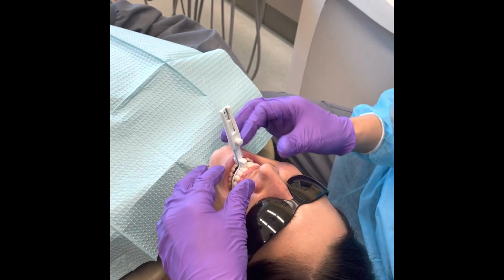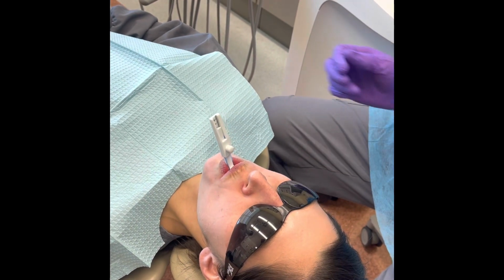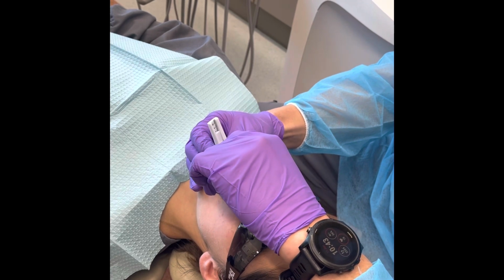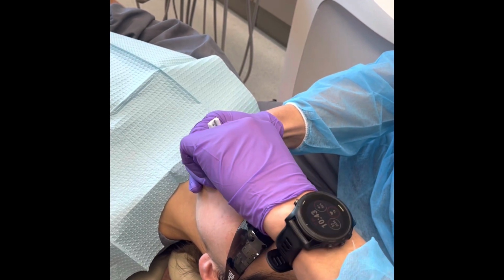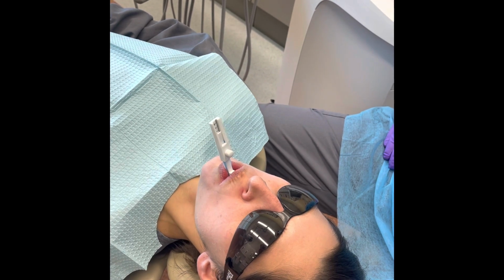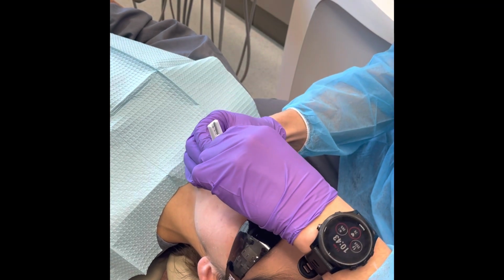All right, so now try to close your lips around this a little bit. Okay, now try to make the snoring sound again. Okay, what I'm going to do is slide your lower jaw a little bit further forward for me. I'll tell you when to stop. Stop right there. All right, go ahead, and I want you to try to make the snoring sound again. Is that harder for you to make the snoring sound now? Mm-hmm.